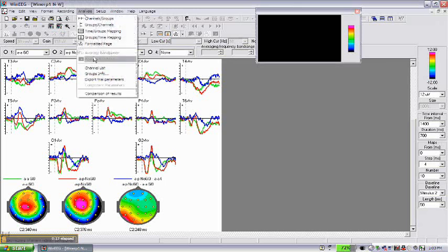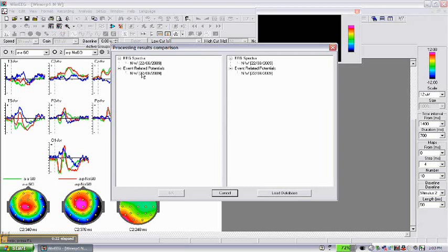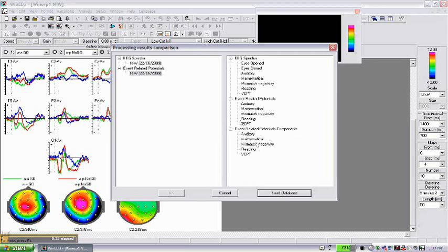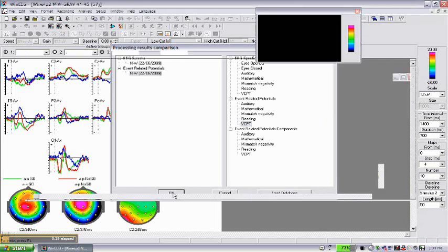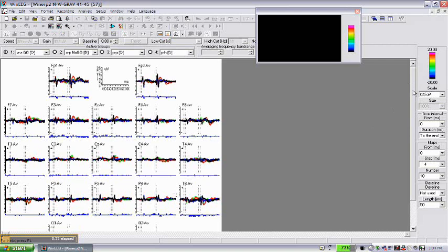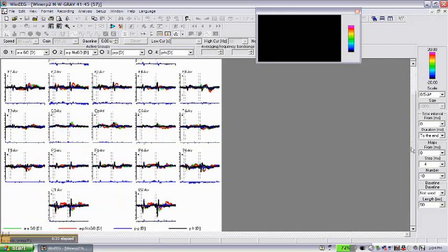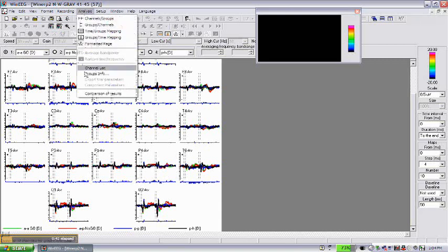Then we can go to analysis and we can compare the ERPs with the database. We compared ERPs with the database, so we go to analysis and we can see the results of comparison with the behavioral data.